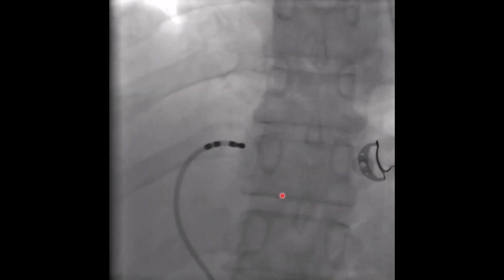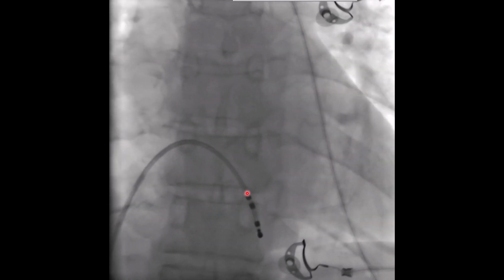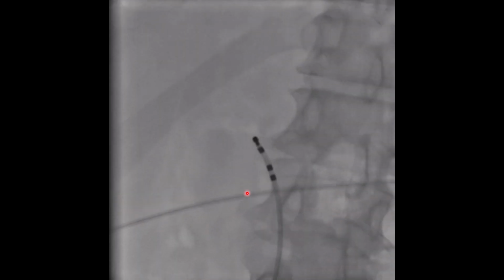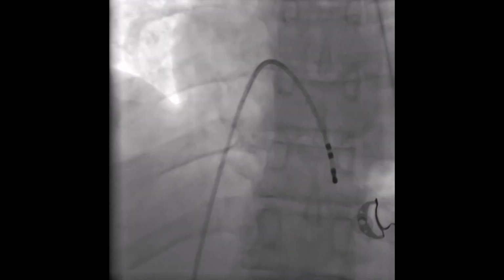If the patient also has heart block and a heart rate less than 30, that can lead to asystole. So it needs to be done more slowly to avoid perforation of the thin wall of the RV.